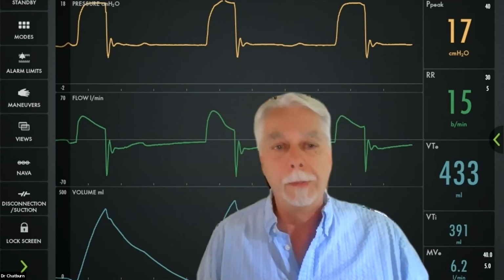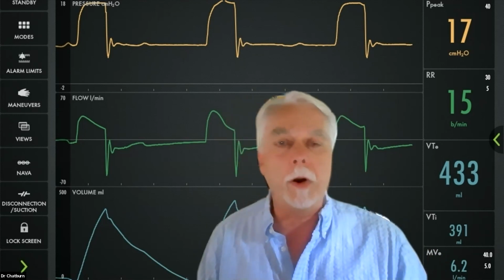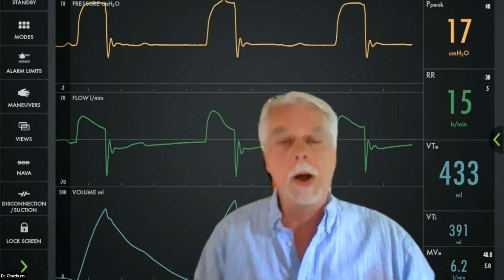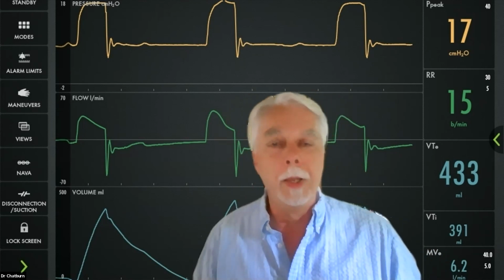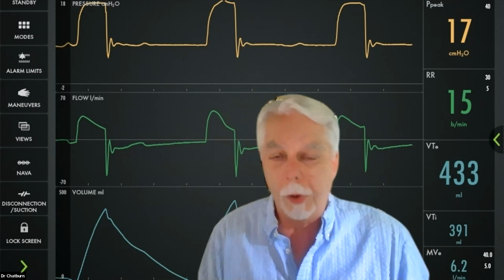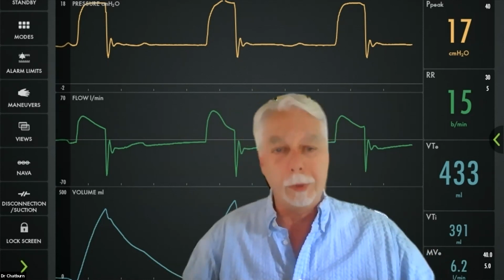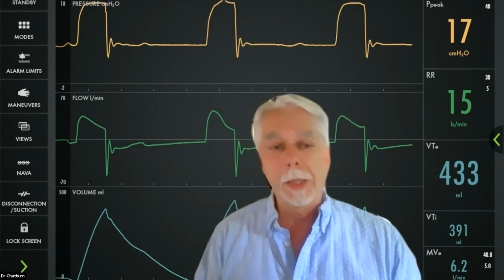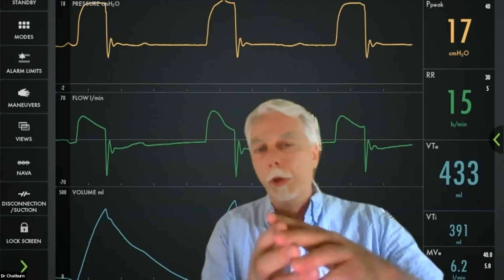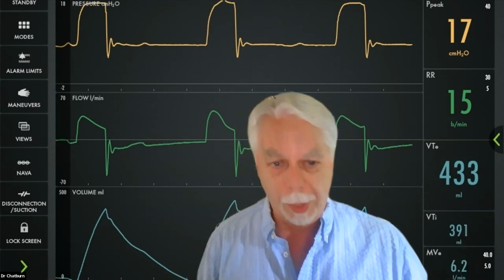End of story. At the other end of the extreme, we have modes that actually have artificial intelligence built in, that monitor the patient condition and adjust on a breath-by-breath basis over time, which no clinician can do, if for no other reason than we're not at the bedside. And in between those two extremes is a whole host of ventilator technical capabilities using combinations of these targeting schemes, and it gets very complicated.